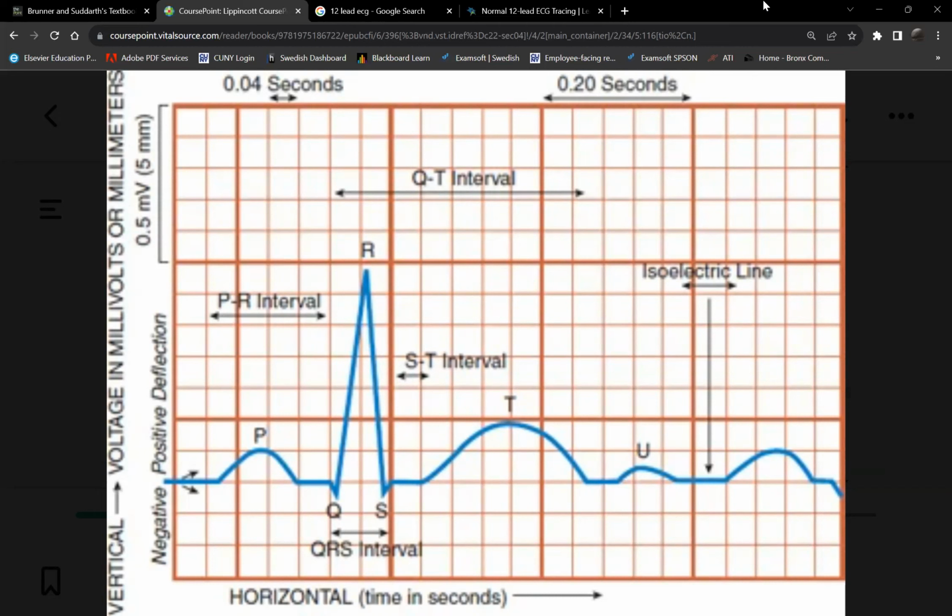So what happens, this appears when, let's say, this is your heart. Someone has a heart attack. It's an ST elevation MI, meaning like this, ST elevation. So that means it indicates the entire thickness of a patient's heart muscle died. The blood clot that caused the heart attack caused actual death of the heart muscle. An entire thickness died. Because of this, the ST segment will appear like this.